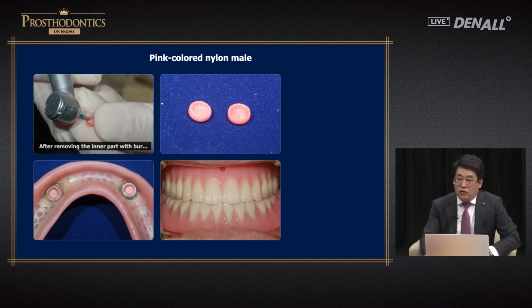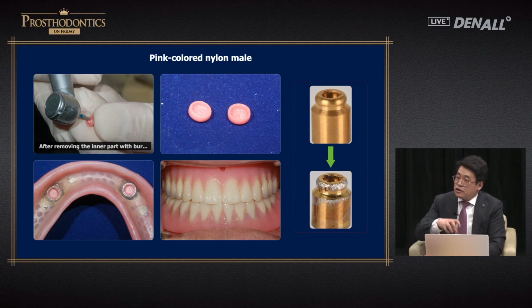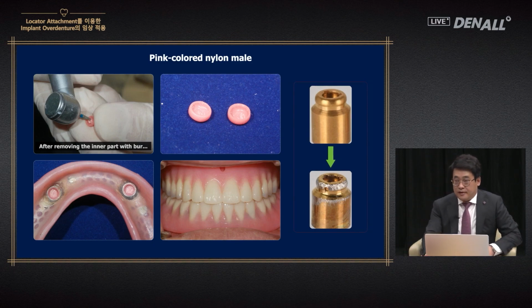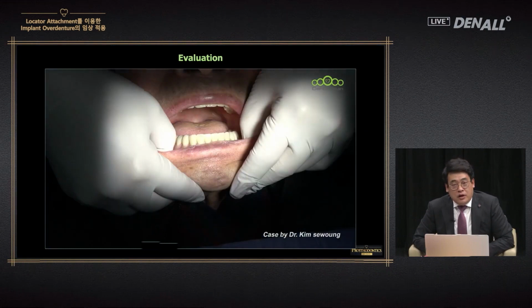And I realized the reason as I did long-term follow-up with a patient where wear occurs like this. So in this case, even if you change the blue to a new one, it's insufficient. Therefore, in this case, you can use pink or white. Don't throw them all away and save a few. You check whether it is attached properly and do occlusal adjustment.